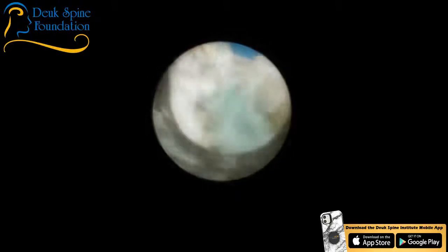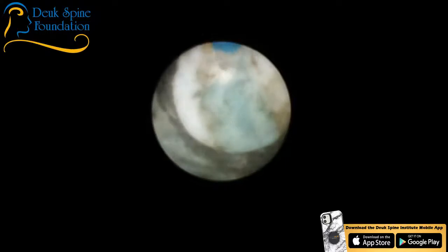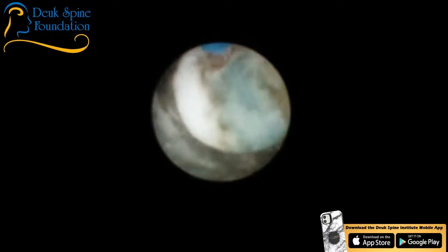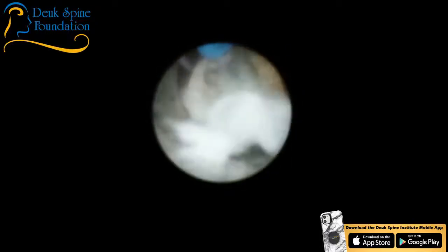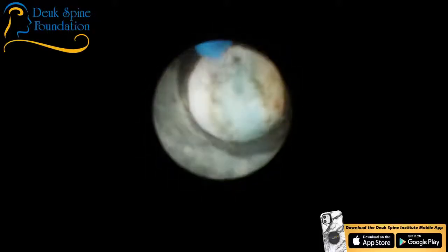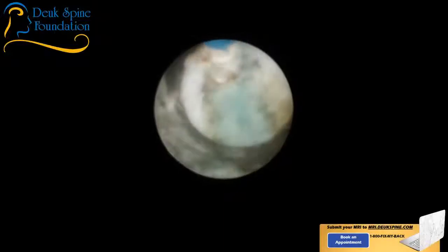Because they're in the foramen, we already know they went too far. They went beyond the borders of the disc. The neural foramen, there is no disc in the neural foramen normally. You should never find nuclear material in the neural foramen. If you find nuclear material in the neural foramen, it came from the center of the disc, and it's out of position. It's called a herniation. It has to be herniated to be in the foramen. And all this stuff you're seeing in the foramen is nuclear material, and now most of it's gone. There's a little bit left.